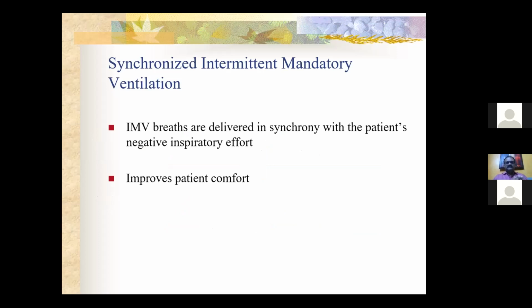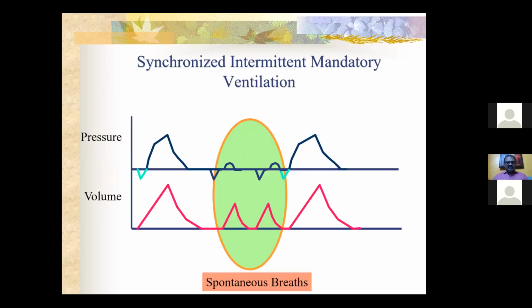This is also another mode where there will be less asynchrony between the patient and the machine, and it improves patient comfort. This is what you're going to see in the SIMV mode, where the spontaneous breaths are also allowed in between, and depending on the pressure support you're going to keep for the spontaneous mode, the machine will support the spontaneous efforts, and in between there will be mandatory breaths.